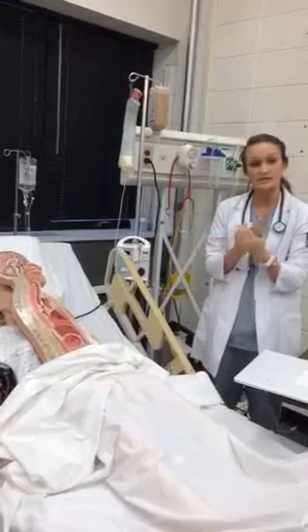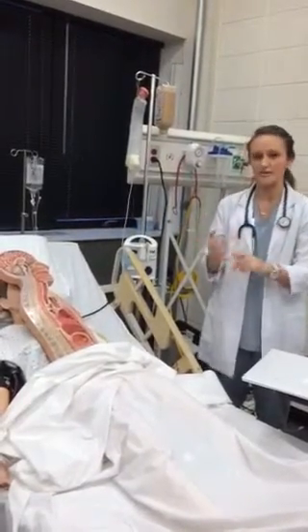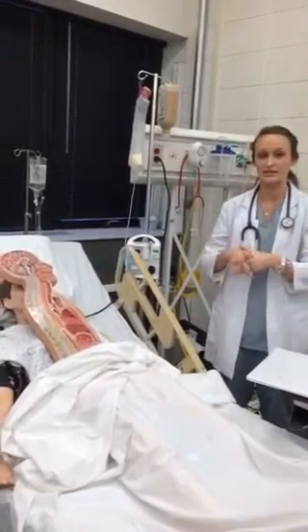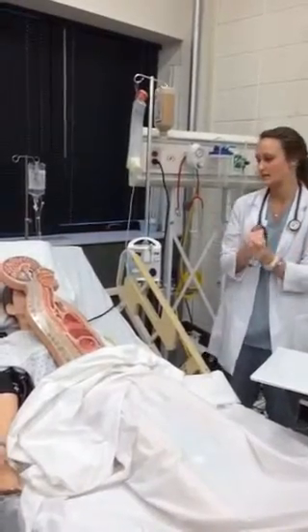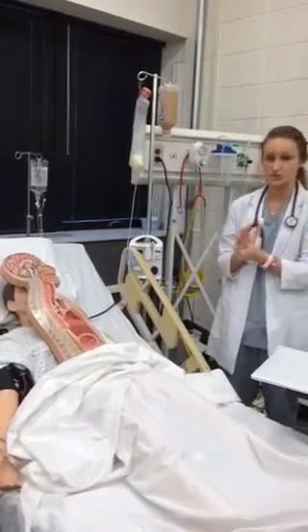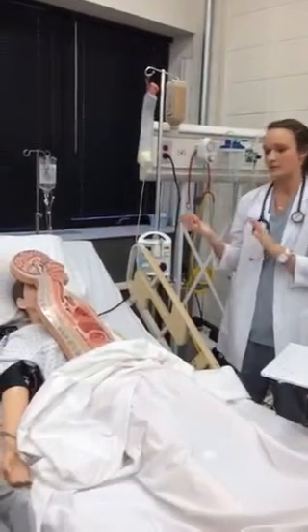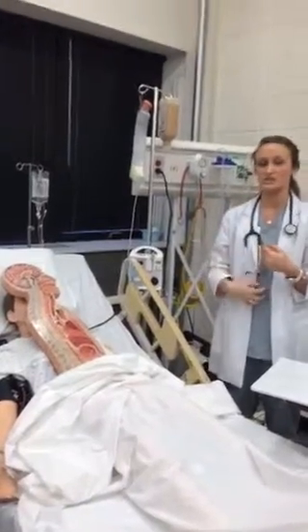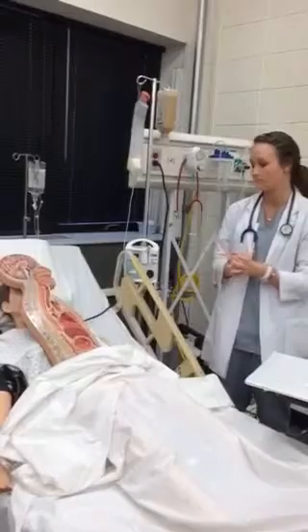I'll go ahead and assess mental status at this point and just ask them their name again, where they are, what day it is, things like that. And then once I've assessed the mental status, I will explain the procedure to them to make sure they know what's going on. So tell them that we're going to be putting a tube down their nose into their throat and just down to their stomach so that we can feed them and give medicines, things like that.